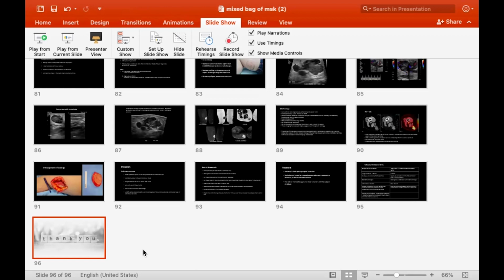I felt it was very interesting to dive deep after ACL. I was just searching because I was not getting the answer why the patient is getting pain. So I started evaluating all these small things.